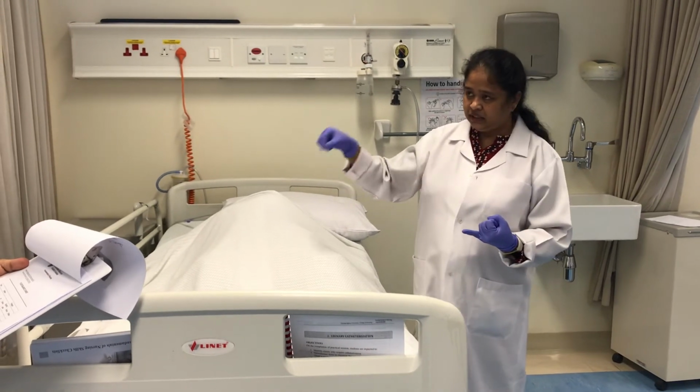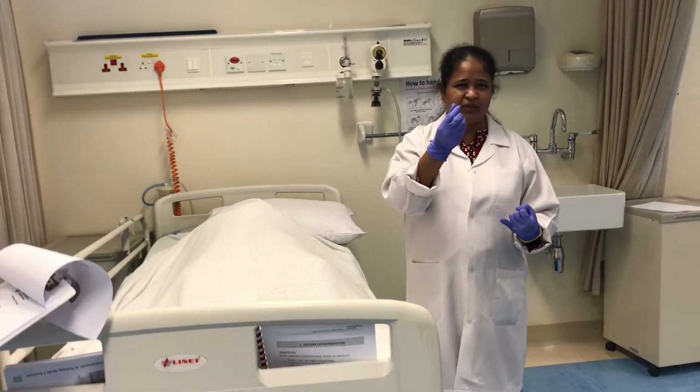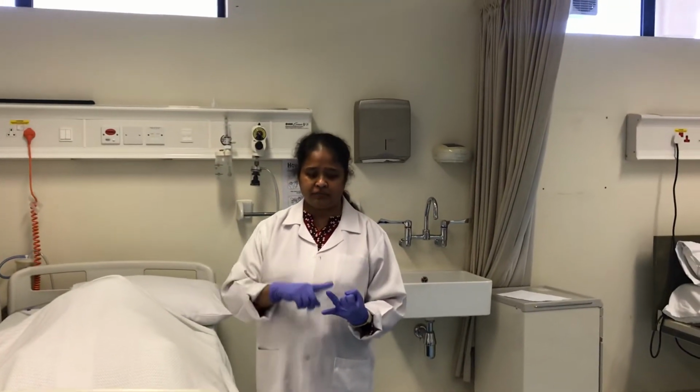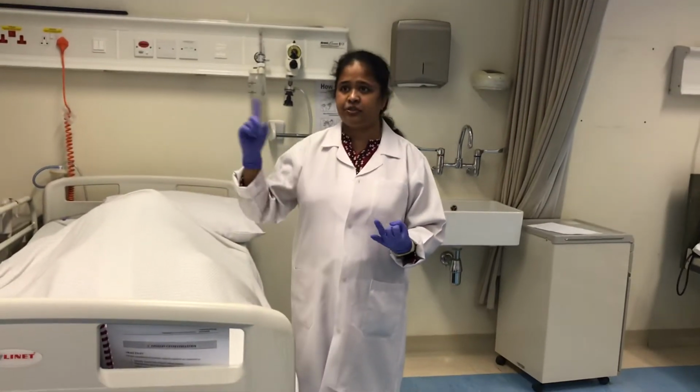And if we find any cloudy appearance or precipitation, which is very common when they are on this for a longer duration, if they find that, it should be changed.